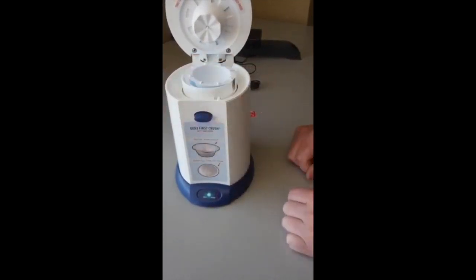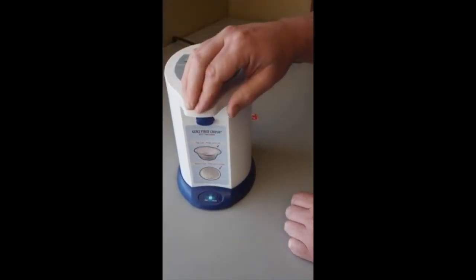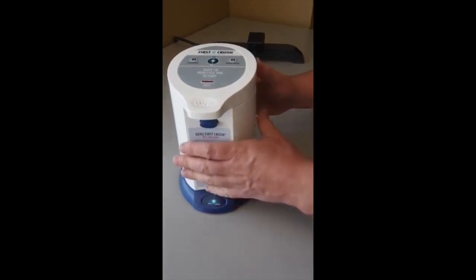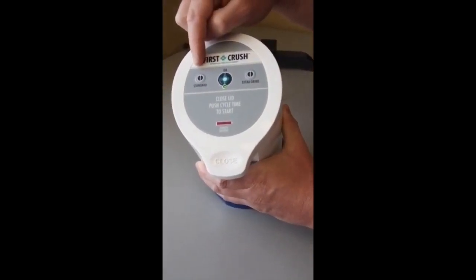Once the pills are placed in the bottom cup, the top cup is placed on top, and then you simply close the lid. And when you close the lid fully, you'll hear a little click that indicates that the lid is now locked and cannot be opened during the crushing cycle. This is to avoid any exposure to the dust of the crushed medication.